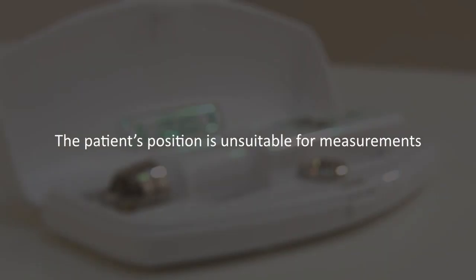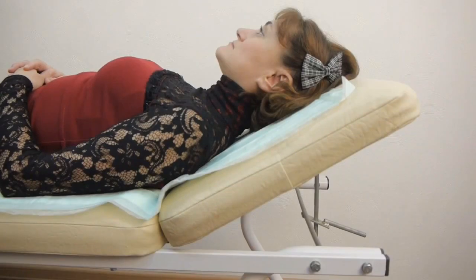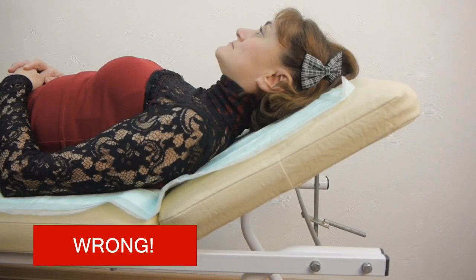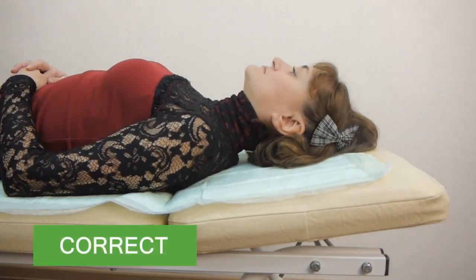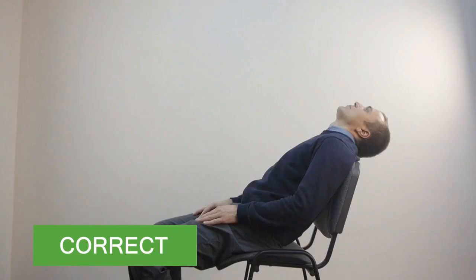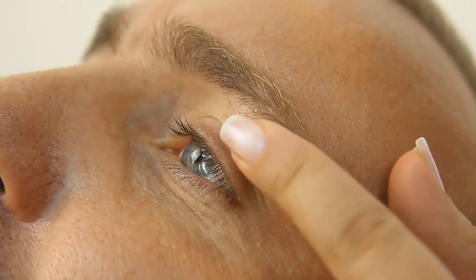The patient's position is unsuitable for measurements. The result will be inaccurate if the patient's posture is incorrect. For precise measuring results, the patient's head must be tilted back parallel to the floor.